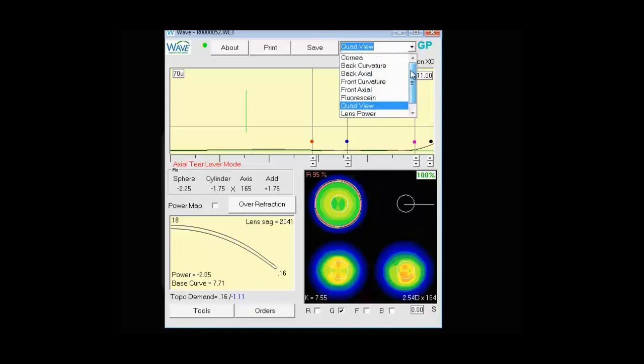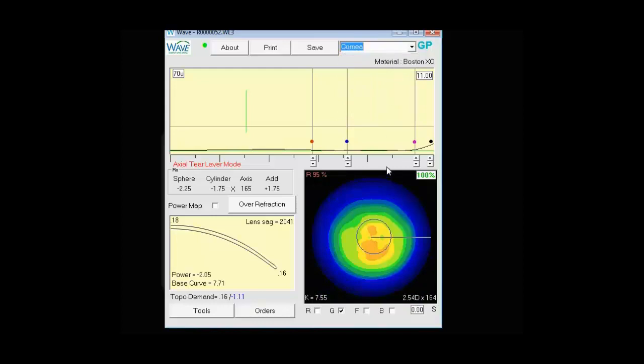If you use the drop-down, you can see you can get more specific if you want to see a larger view of the imported cornea. Back curvature, back axial, front curvature, front axial.